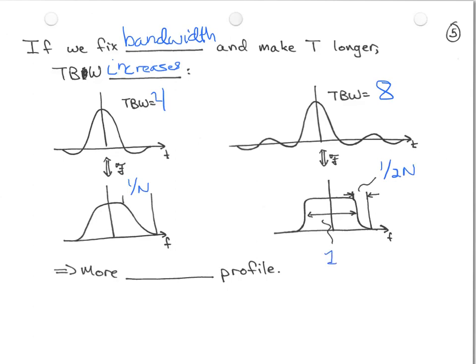At the same time, we're going to have the same excitation width, but half the transition width. And so what we have here is what we would call a more selective profile. We're going to have less leakage of signal from adjacent locations right next to the slice. We have here a better approximation of our ideal rectangular excitation profile.